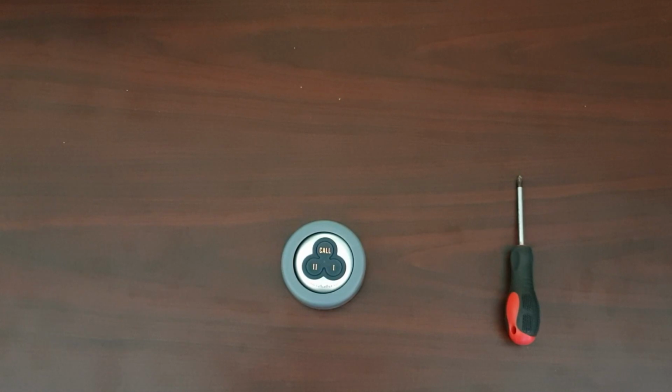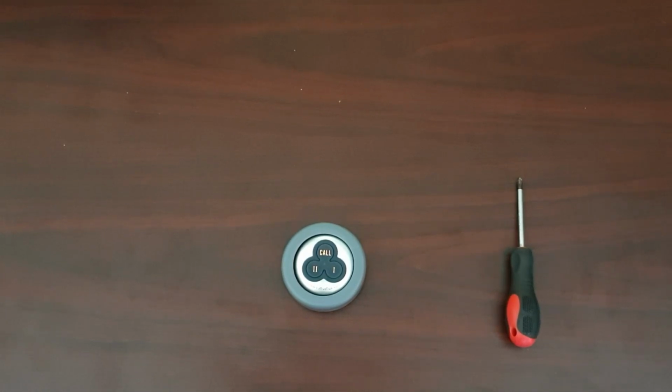Good day. In this video I'll be showing you how to check if the battery is low or flat, how to take it out of the holder, and how to change the battery if need be.